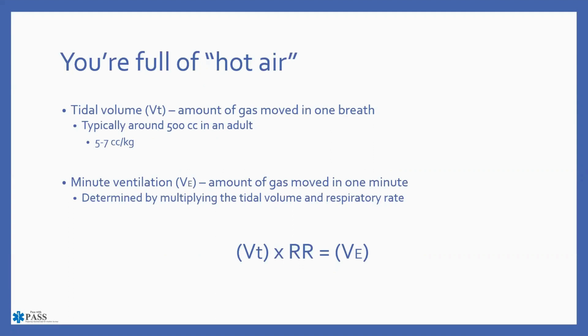If the patient still does not seem like they're coming around, they're not ventilating, and this is a whole different topic as far as ventilator strategy, you can increase the tidal volume that the patient is getting. You can increase your respiratory rate, you can increase your FiO2, or the amount of oxygen that you are actually delivering to your patient.